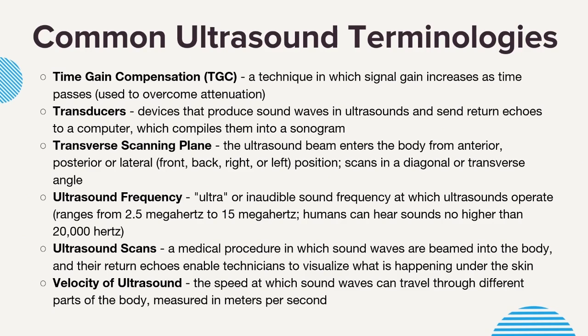Ultrasound frequency: the ultra or inaudible sound frequency at which ultrasounds operate ranges from 2.5 megahertz to 15 megahertz. Humans can hear sound waves no higher than 20,000 hertz.